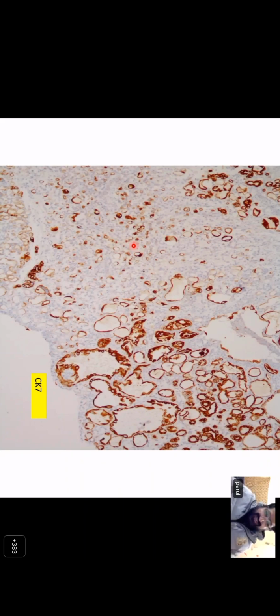So see, bladder can have signet ring cells, and I think Verma sir would agree that we can see that. But if you see a signet ring cell carcinoma in the bladder or urethra, the first thought process which should come to your mind is whether it's a rectal cancer. That is the thought process. It's a very adjacent organ. In a male, you don't have the uterus, you have a bladder which is adjacent to the rectum. So you should think of a colorectal signet ring cancer which is infiltrating the urethra or the bladder. That's the thought process. Fine.